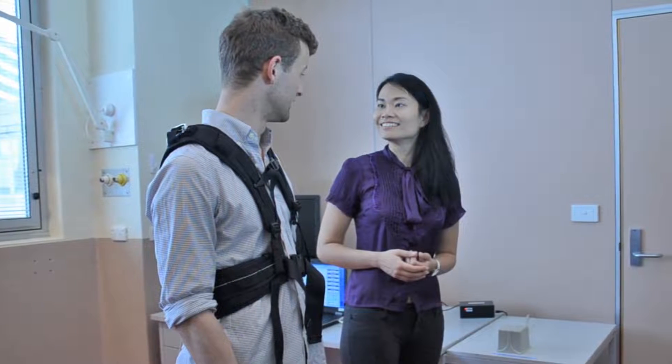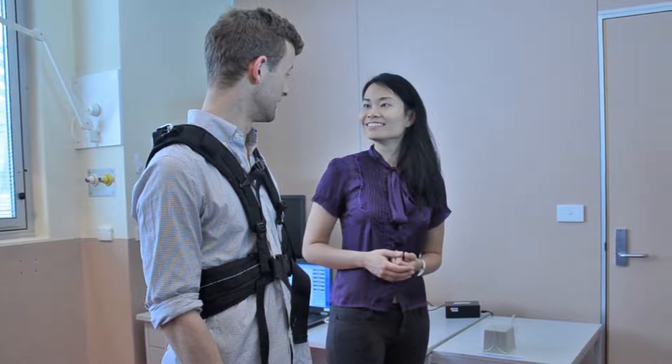Ultimately, the instrumented pull test is used to characterise postural responses that are produced by the clinical pull test. It can also be used to determine variabilities that influence pull test performance.